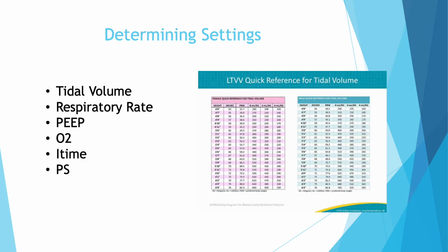And then pressure support is not going to matter unless you have a spontaneous breather. So pressure support does not even matter unless the patient spontaneously breathes. Even if you're on SIMV, synchronized intermittent mechanical ventilation, if your patient doesn't have spontaneous effort, then the SIMV does not matter. That means you're just basically in the control mode of the mode you're in.